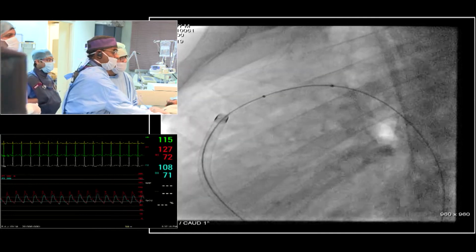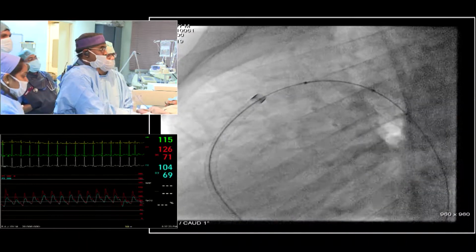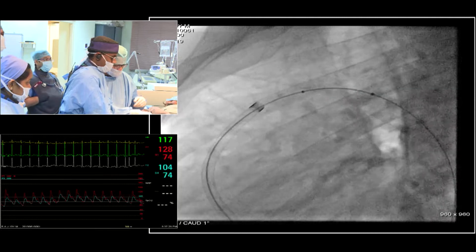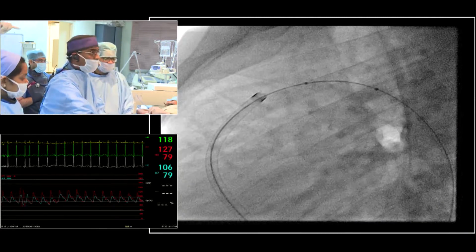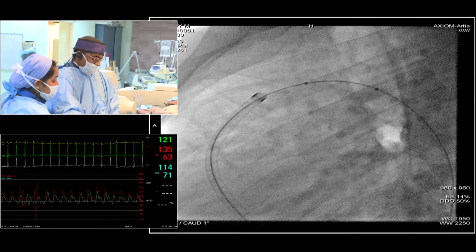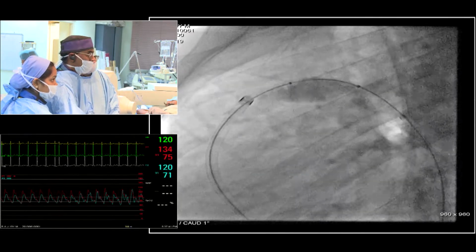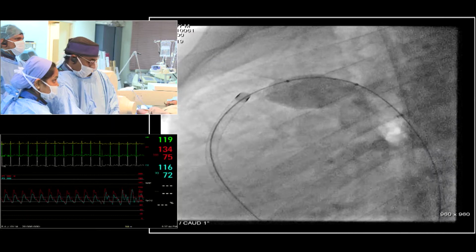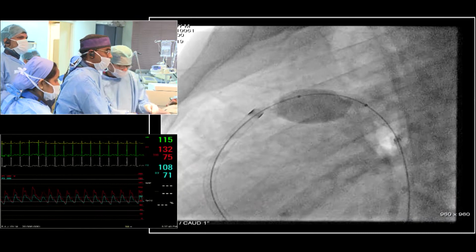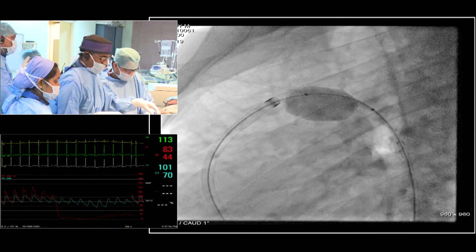So now we are going to keep the ductus in the middle, the balloon in the middle, and now we are going to inflate the balloon. So the hemodynamic screen, and yeah, I think it's already there. Now what we are doing is we are going to be inflating this balloon partially. Sandeep, you give a pull on the balloon, like keep a pull. Okay.